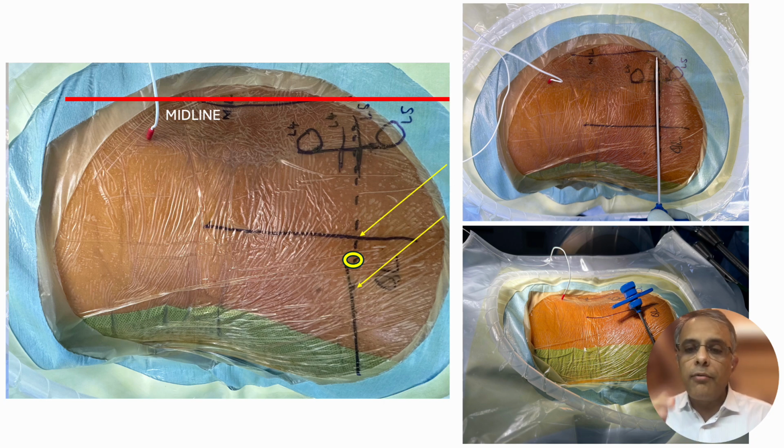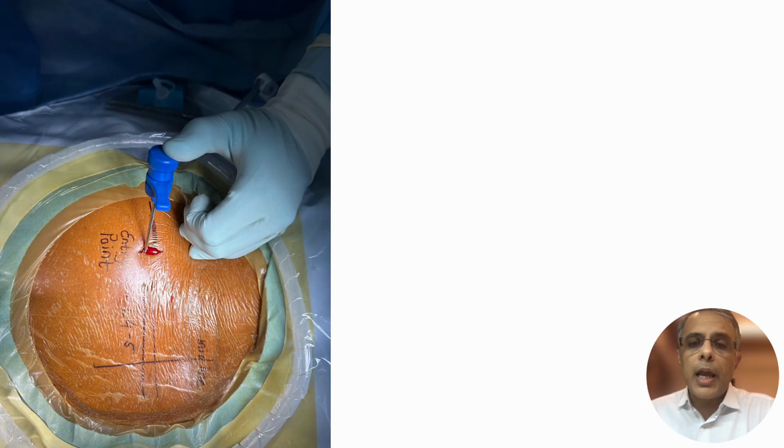But here we have to go from the posterolateral corner of the annulus to the anterolateral corner of the opposite side annulus, and that is why you will have to do an orthogonal maneuver in a reverse position from what you do in OLIF. In OLIF, we generally do the maneuver to keep the cage in horizontal position. Here the orthogonal maneuver is done to put the cage in a more oblique fashion. So this is the entry point, how I would take my entry.